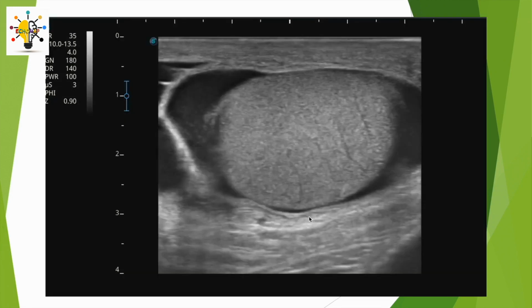So, another cut here, more focused on the testicle. I've given you a dynamic demonstration. The testicle is seen with normal echogenicity overall, which still takes on a slightly streaky appearance, a little more striated than normal, and then this important hydrocele that really molds the testicle as a whole, with its rather large septations in the scrotum.